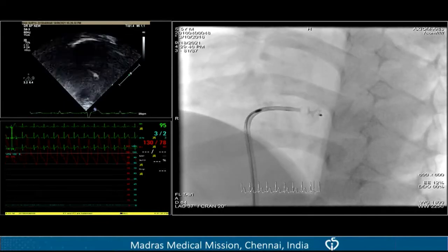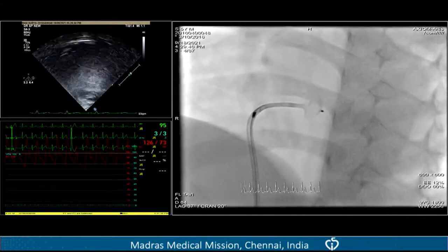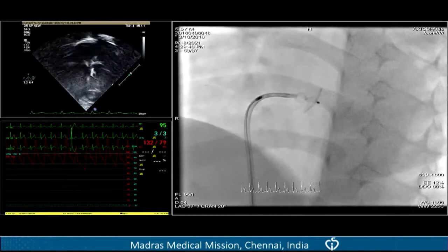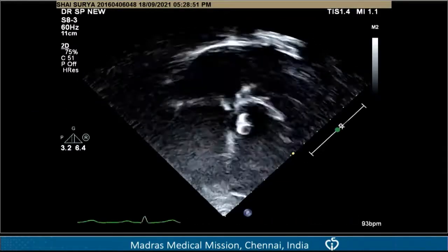Yeah, so now I am going to pull back and hug the, okay, keep showing that. At the moment, Shiva, you're purely doing echo, not fluoro. Yeah, no fluoro. Can we do echo big then? Echo big. Nice. Thank you. Consistently show the picture.